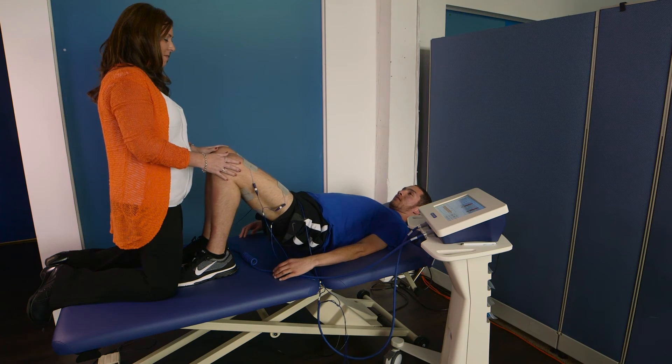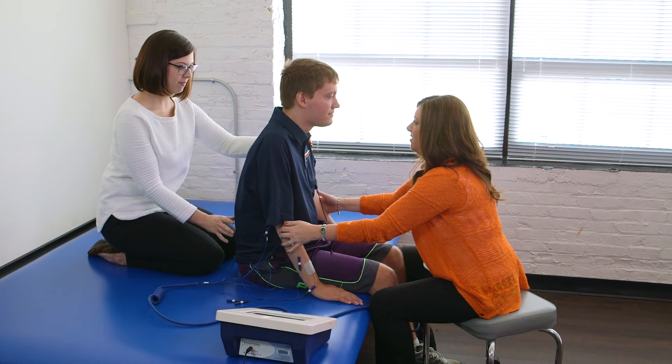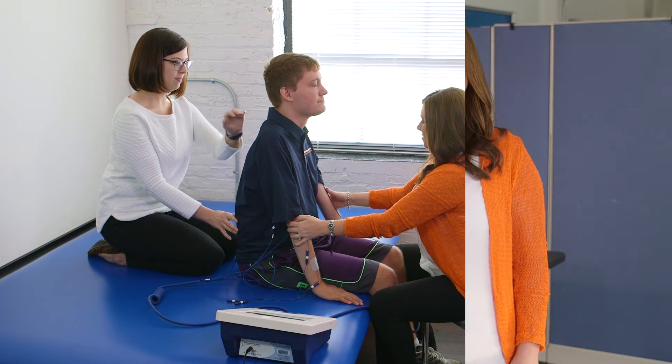The general activity library includes therapy programs for activities including bridging, postural correction, and others. Excite also provides you with the ability to make your own unique therapies and save them into your clinic's private library.